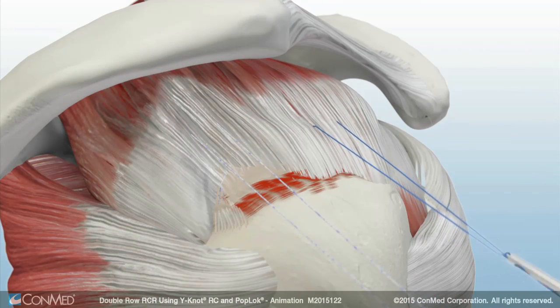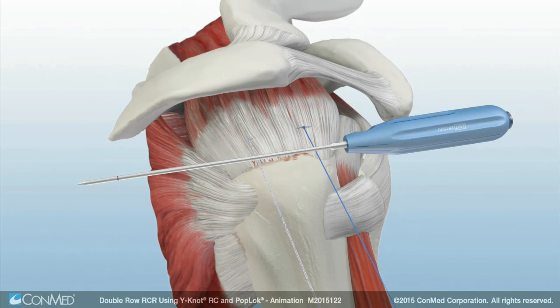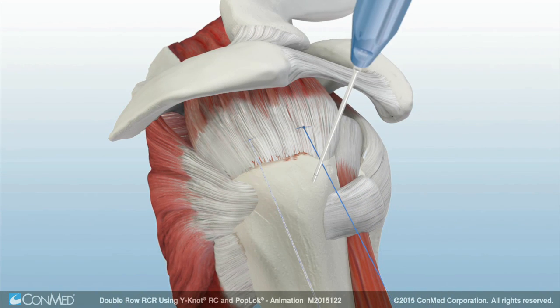Sliding knots are tied to secure the tendon to the medial footprint. The pop-lock punch is inserted down to the laser line.